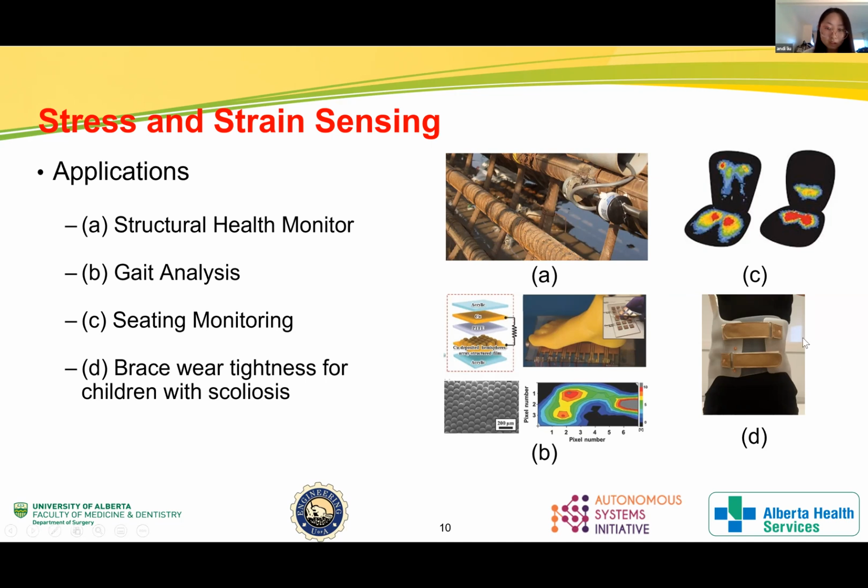The last figure shows the brace for scoliosis treatment. Stress and strain are measured to determine the brace wear tightness. So for both applications, long-term monitoring is required. In that case, a large amount of data will be collected.